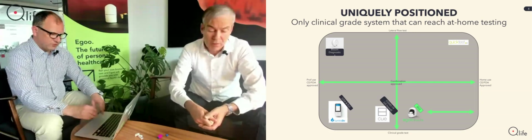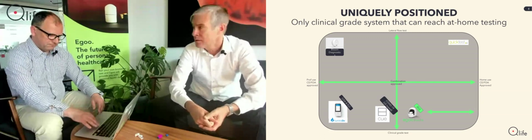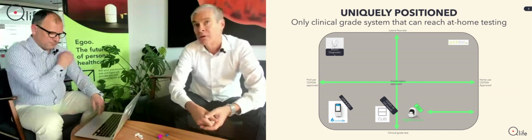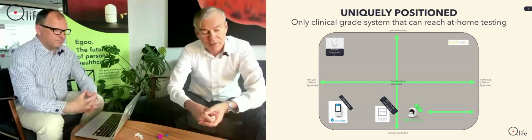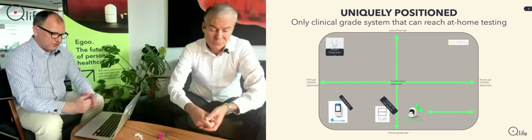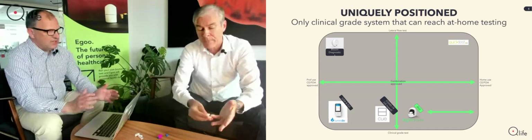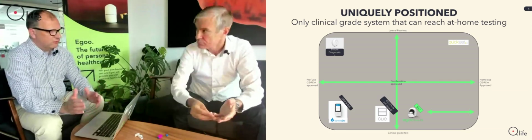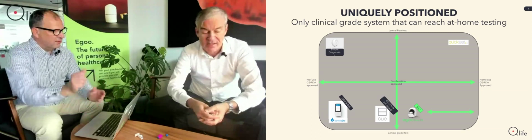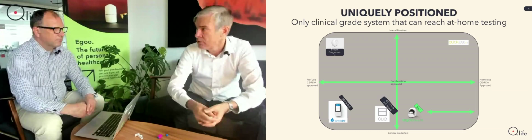So you refer to these new IVDR rules? Yes, absolutely, yes. So we are regulated the exact same way as a central laboratory auto-analyzer in the central lab. So exactly the same, and in fact, some of our Egoos are sitting in those central labs. Okay, yes. Yeah, because there's a question actually about IVDR rules, when do they kick in? So we have the CE marking and we have the IVDR rules. Yes. The first step for you is to get the CE mark for your product today. Yes, so the CE marking really relates to under the new IVDR regulation.